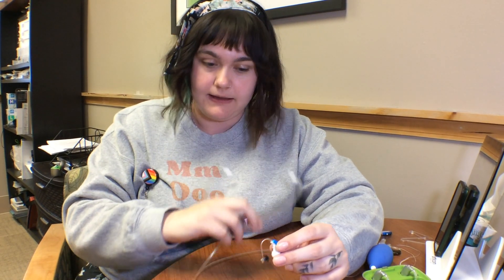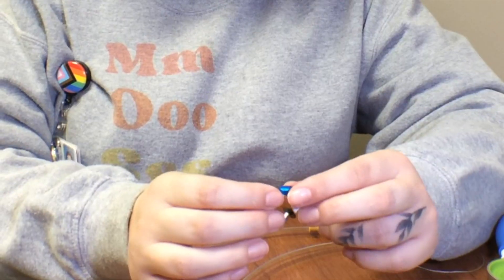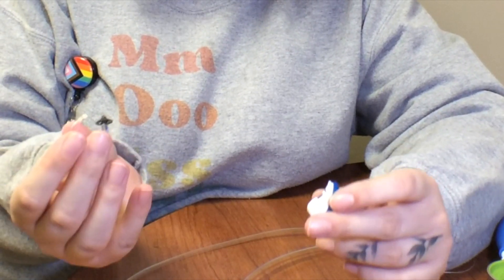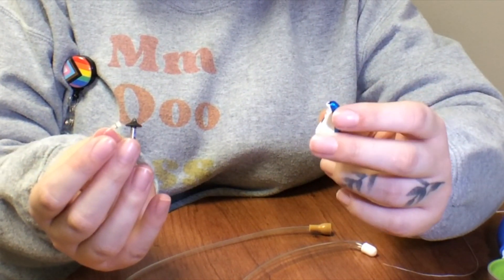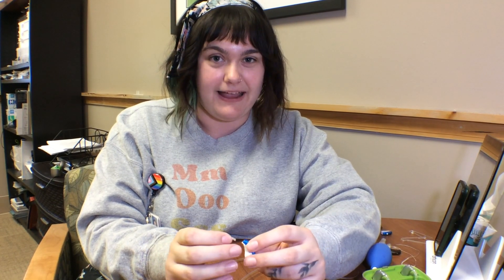If you happen to have a spare receiver that you know is working, and you're comfortable and familiar with the type of hearing aid, you can take this piece off, put the other receiver in, and test with those same Ling 6 sounds. If you don't have that on hand, that's okay — have your audiologist take a look at it.